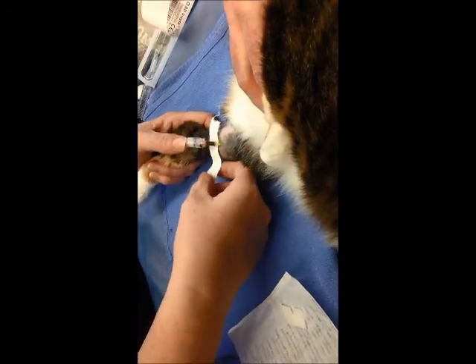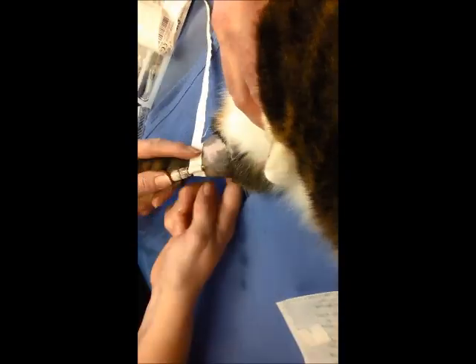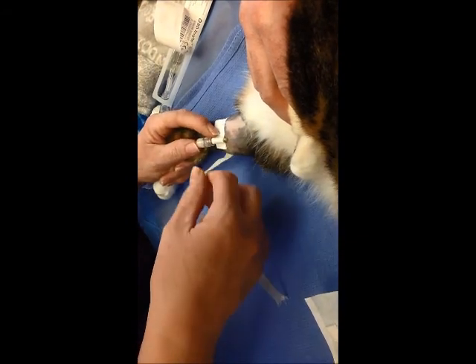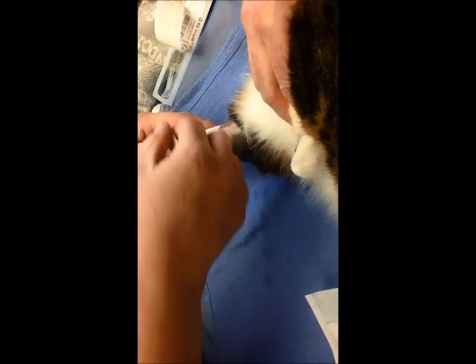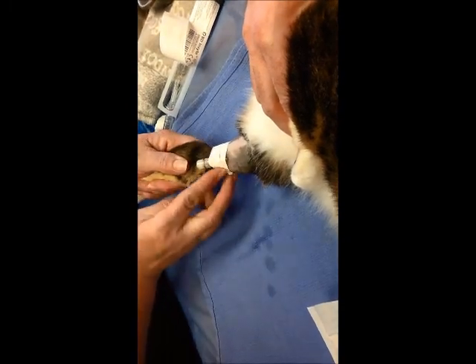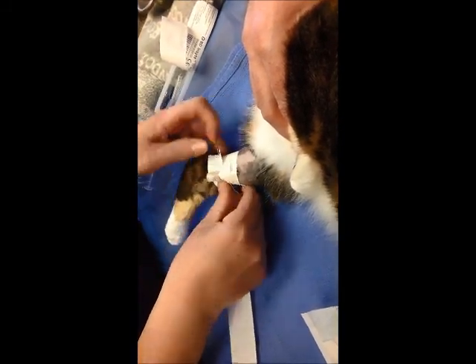First piece of tape is going to go sticky side up underneath the hub of the catheter. Larger 1-inch piece is going to go sticky side down.